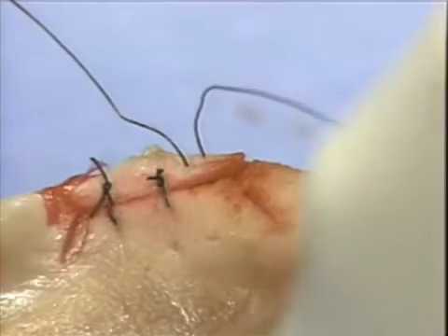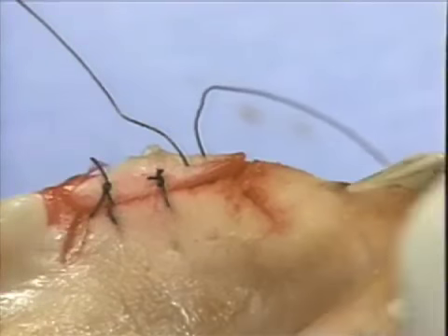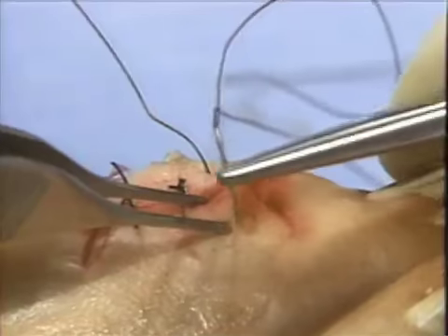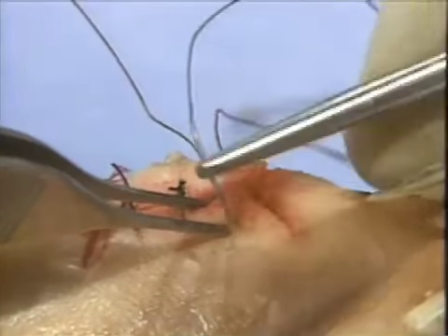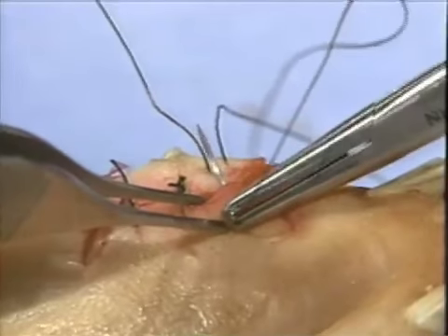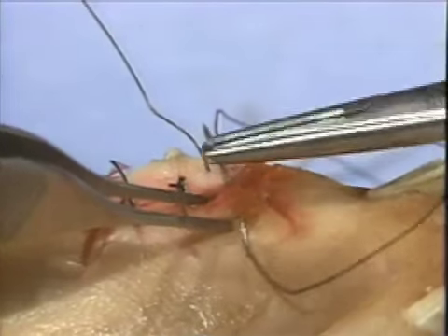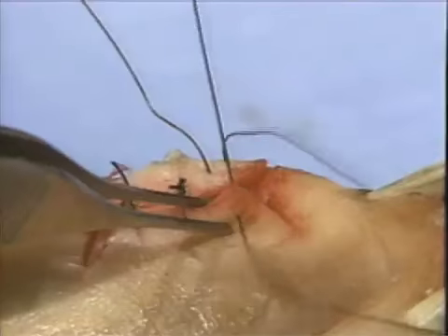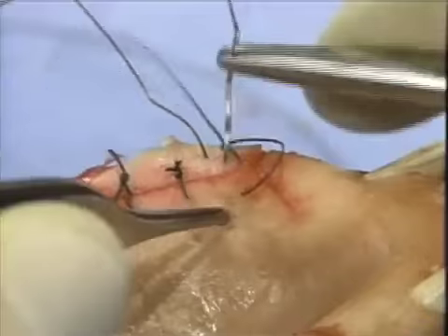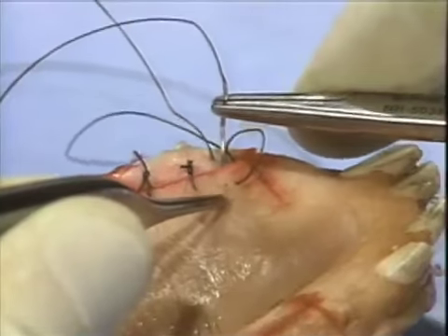The same process is repeated on the lingual flap, either to produce two parallel suture lines or a crossover design. In this example, we will demonstrate parallel suturing. Again, the suture needle is advanced from the oral side of the flap to the tissue side, on the mesial first, and then is reversed in direction on the distal from the tissue side of the flap to the oral side of the flap.